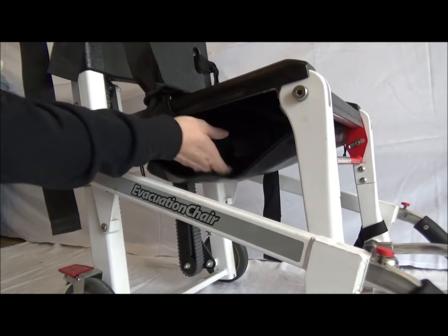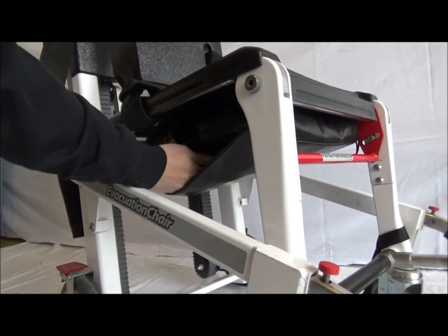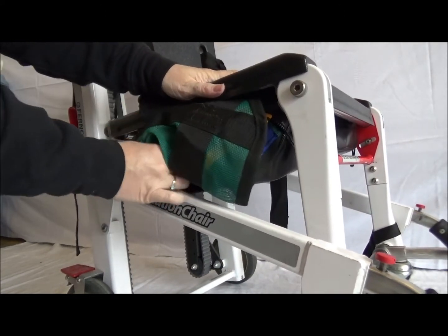When needed, unzip the side of the device, reach inside and pull the device out. At first it may seem awkward, but the more you use the device, the more proficient you will become at removing it.